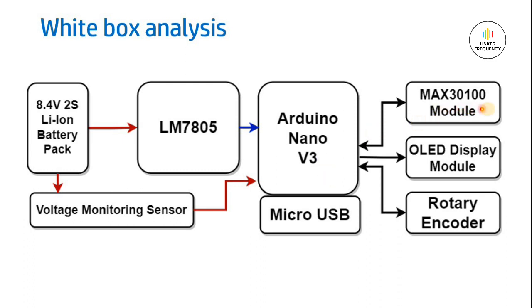The MAX30100 module is connected with the Arduino Nano development board via the I2C bus so that we can access or control this module, which measures the heart rate and SpO2 of a human body. Then we will have an OLED display which is connected to the same I2C bus with a different address, but to the same microcontroller. Via programming, we can display the heart rate and SpO2 measured on the MAX30100 module.